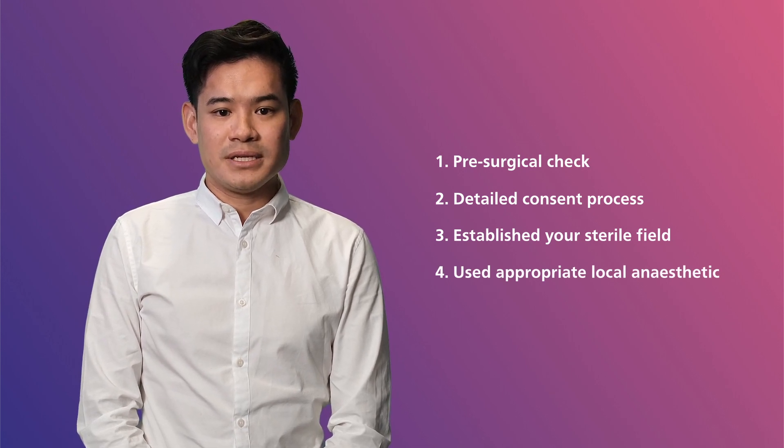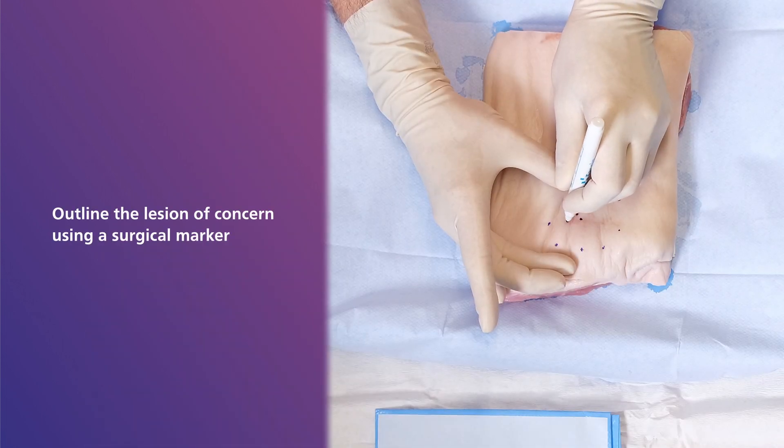Once these have been completed, we can start the procedure by outlining the lesion of concern using a surgical marker.